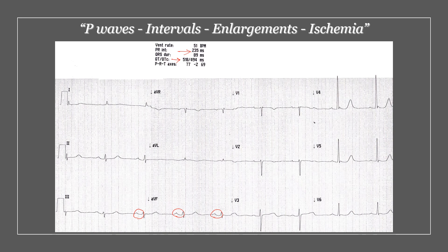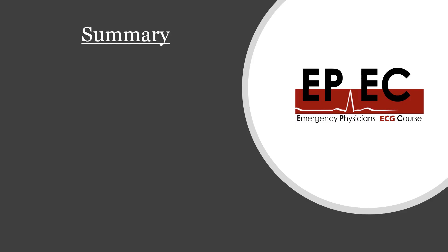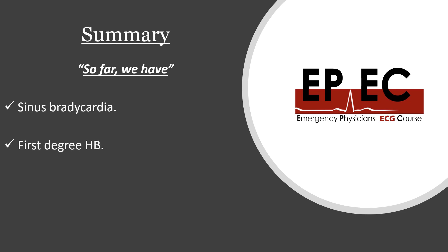So: prolonged PR interval, prolonged QT interval, no specific signs of enlargements in this ECG. And in terms of ischemia, I can say that the T wave is inverted in AVL, inverted in V1 and V2. But I cannot really see any significant ST elevation or depression or Q waves anywhere in the ECG. So in summary so far, we have: sinus brady, a first degree heart block, long QT interval, in addition to some non-specific T wave changes that we've seen in a few leads.